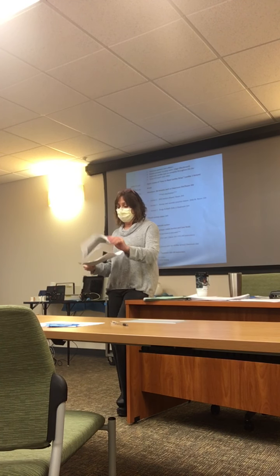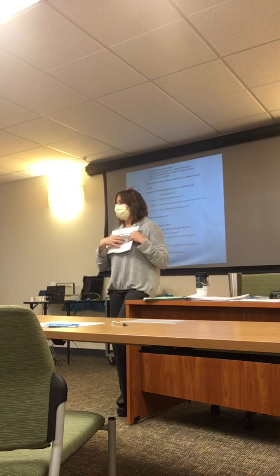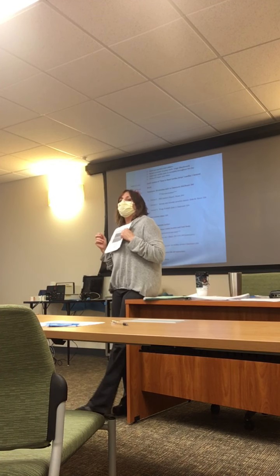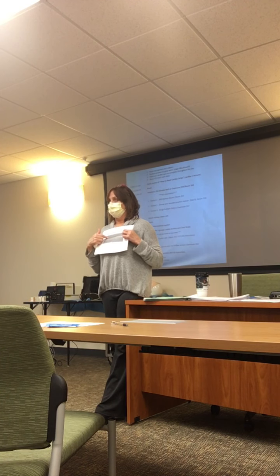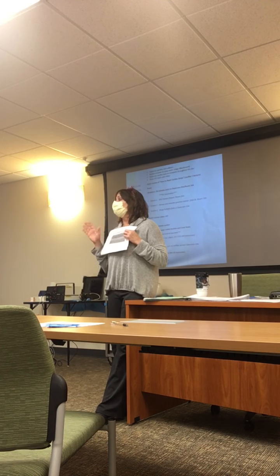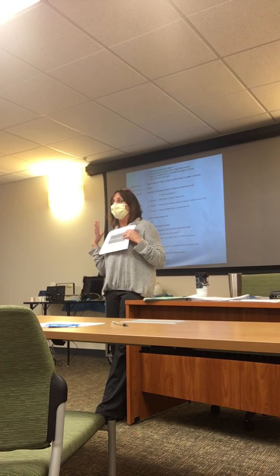Whereas if they don't have a pulse with ventricular fibrillation, this is a shockable rhythm where we use the defibrillators. So you remember when you guys took BLS and you had the AED and they're analyzing the rhythm? This is the rhythm the AED is looking for because it can shock them. You don't see that with the AED, but this is the rhythm that it would just defibrillate. It doesn't matter where in the cardiac cycle it's shocking them, it's just going to shock them.